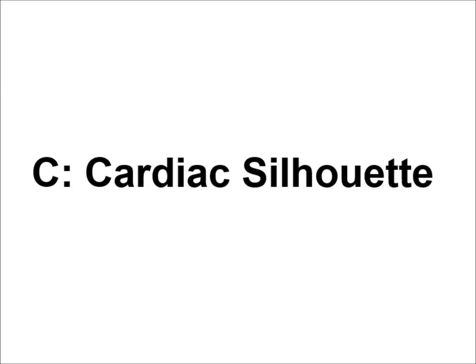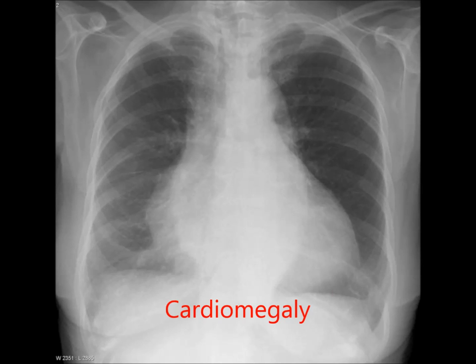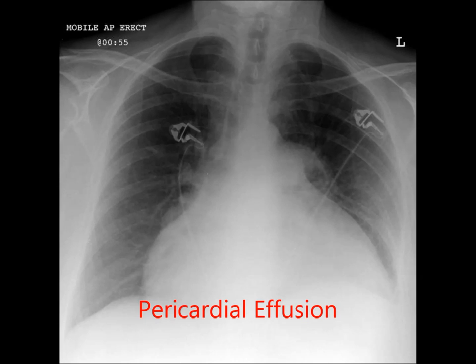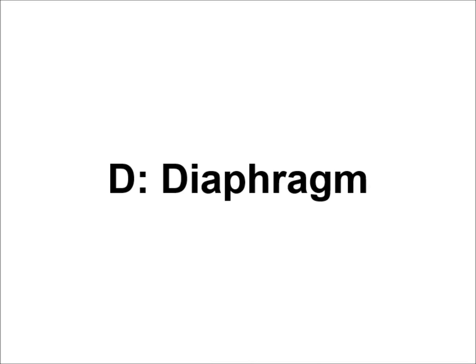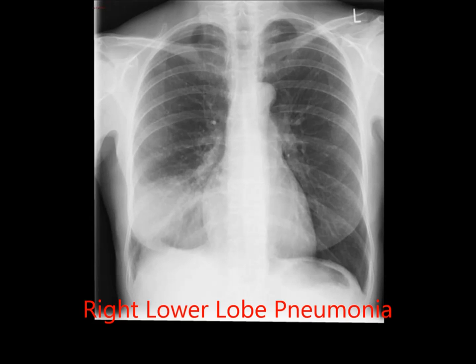C is the cardiac silhouette. On a PA film, the heart should be less than half of the chest width. An enlarged cardiac silhouette is most commonly caused by cardiomegaly; pericardial effusion is another important cause. D is the diaphragm. A normal diaphragm has a sharply visible border, curves downwards at the edges, and the costophrenic angles should be clearly visible, as should the cardiophrenic angles. A poorly defined hemidiaphragm might be due to lower lobe consolidation, whilst a blunted costophrenic angle is likely due to a pleural effusion.